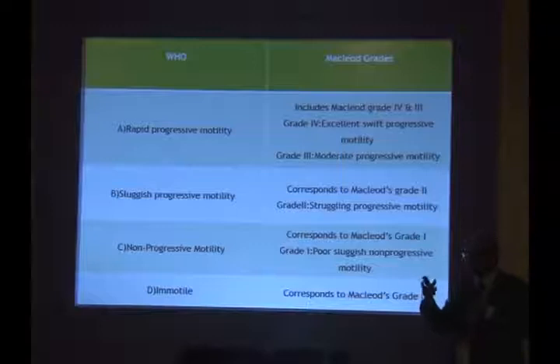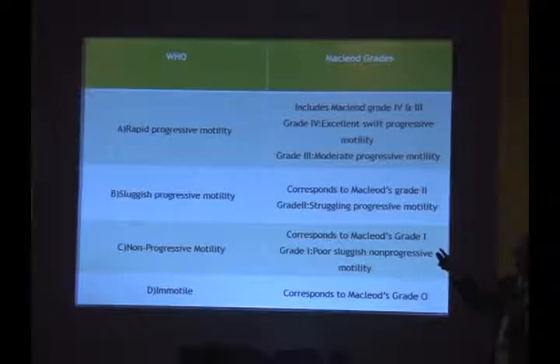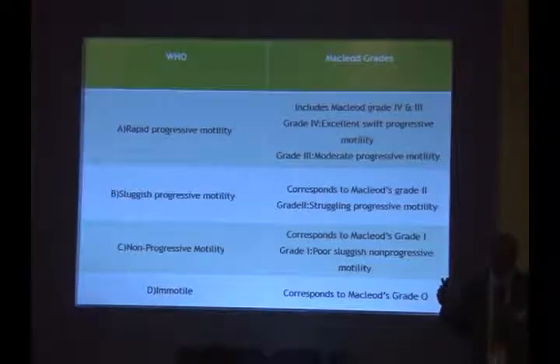That's why some of you say so and so told me that you have progressive, non-progressive and non-motile. You can also write rapid progressive and sluggish progressive totaling progressive. So it doesn't change the percentage, but the information about rapid progressive is lost in only progressive. So you may not have a single rapid progressive sperm, but your percentage motility, which is only progressive, would remain the same. I hope this clarifies issues about motility.